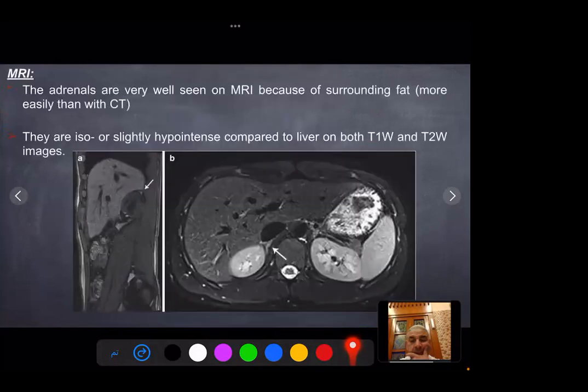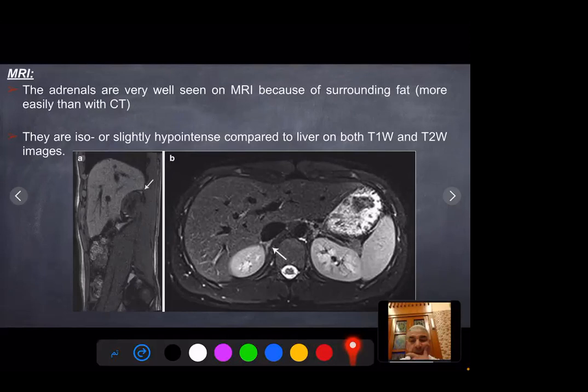MRI: the adrenal glands are very well seen on MRI because of the surrounding fat, more easily seen than with CT. They are slightly hypointense compared to the liver on both T1 and T2-weighted images. Axial and sagittal MRI sections demonstrate the adrenal glands.